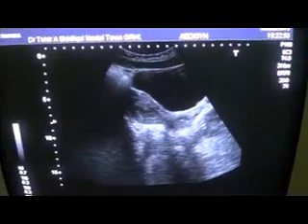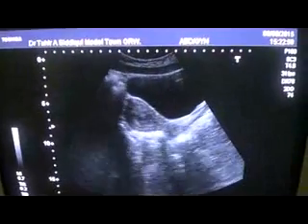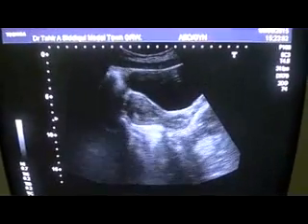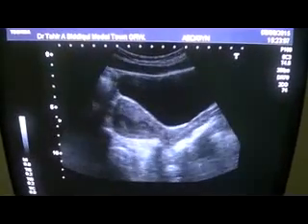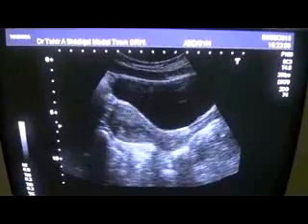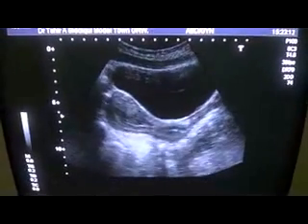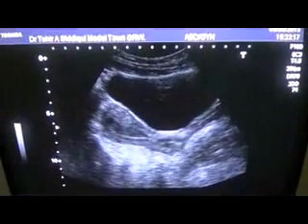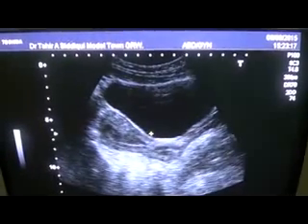This is an ultrasound study of a 32-year-old married female with a history of primary infertility for the last 3 years. In front of you at present, what I'm showing you is the uterus with the vagina, aligning the uterus and vagina both together. And here you can see that the uterus is normal in size.